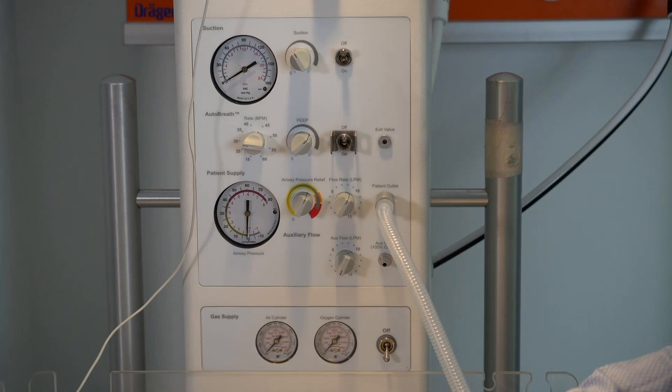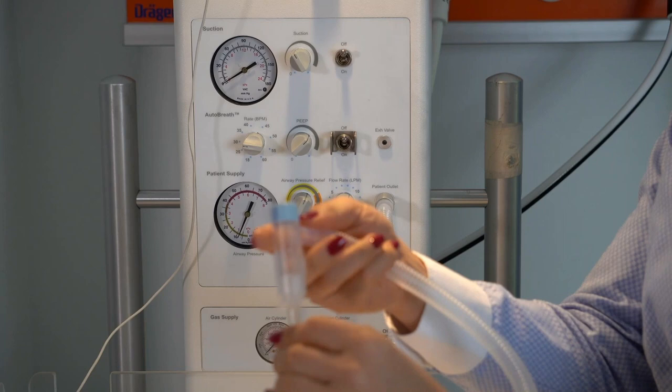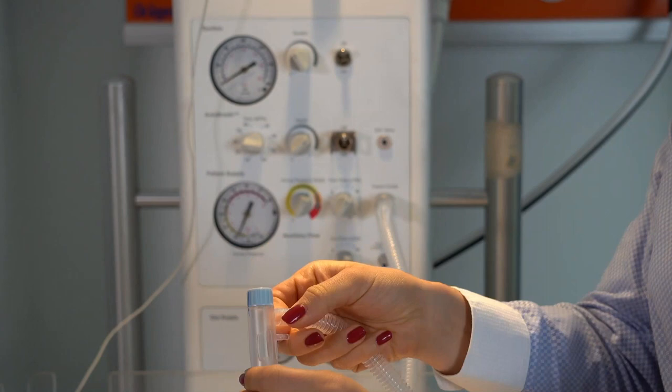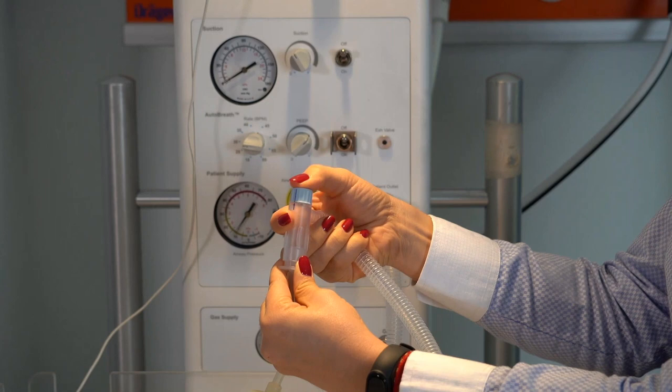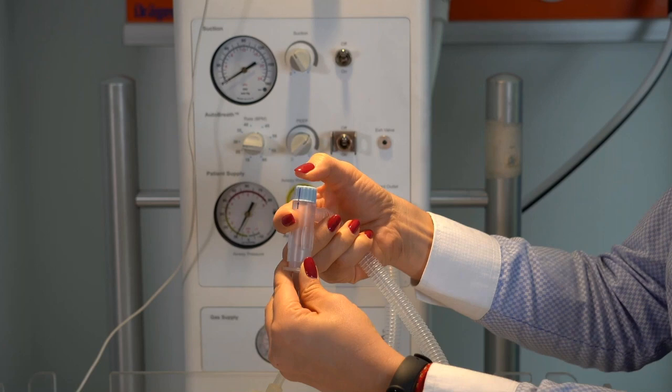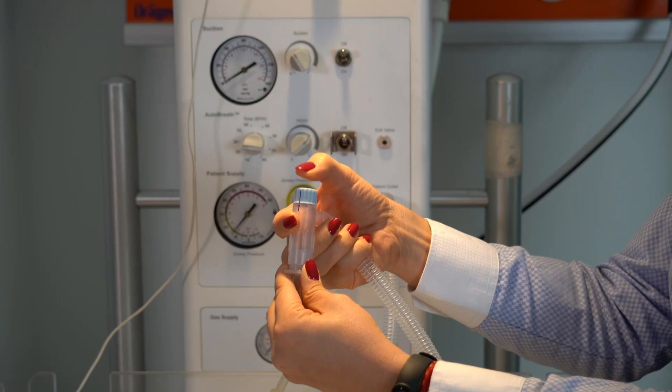So now, how do we perform a T-piece resuscitation? As I mentioned, we have the T-piece resuscitation. So now, let's imagine we place the patient, or we place the T-piece, and we now perform the resuscitation. And you see that when I do this, our pressure gauge is working, and we can see how much pressure we are actually delivering to our patients.